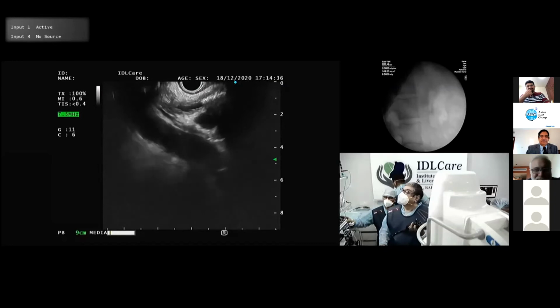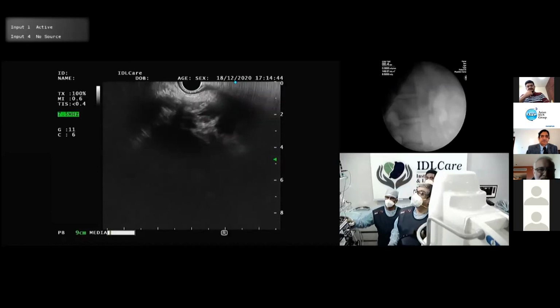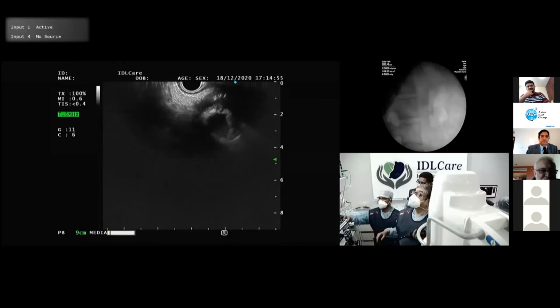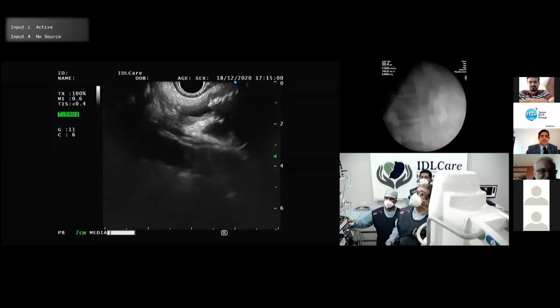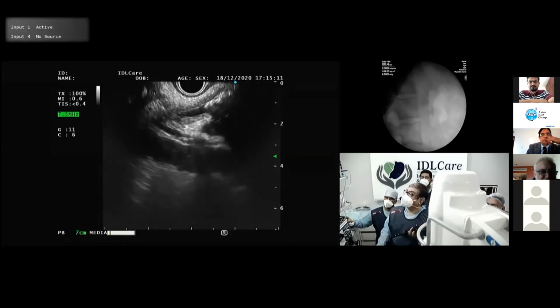So I would not say this is an ideal case, because there is a dilated pancreatic duct, no doubt. We can puncture it, but I am seeing stones inside. And I feel there is some atrophy in the pancreas also. See this, so many stones are there inside. Layering. Stacks of stones. So I can do it technically, not an issue. We can try puncturing the pancreatic duct.